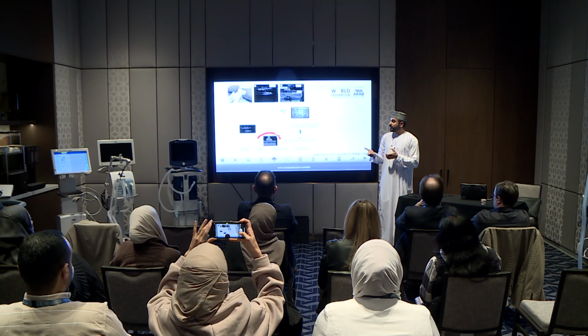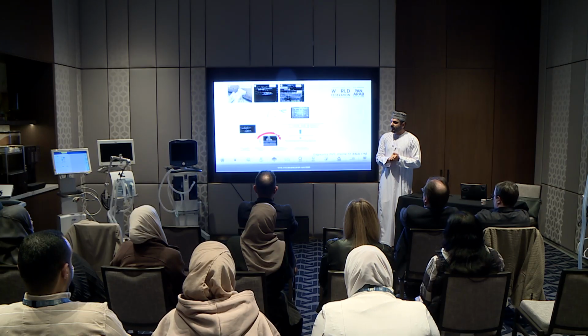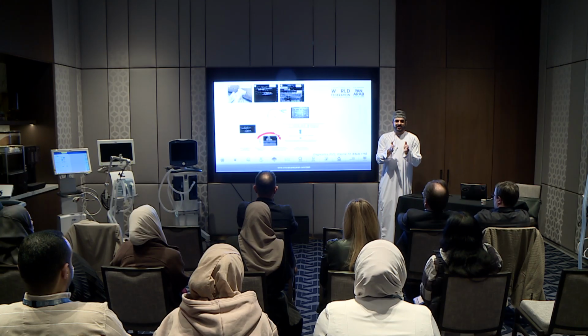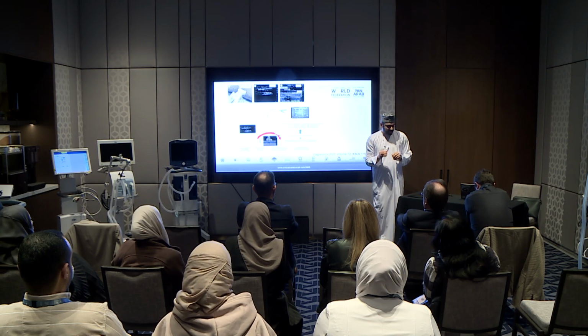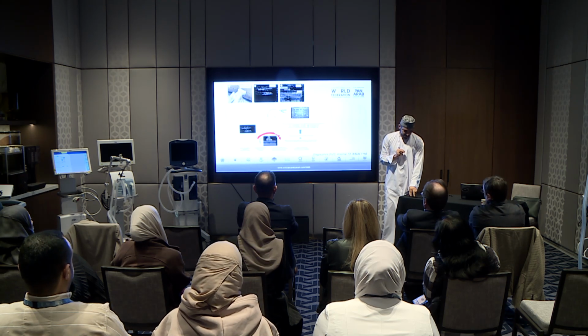So this is occlusion pressure and how it's correlated to the respiratory drive and respiratory effort. If you have now a patient with high respiratory drive and high respiratory effort, what would be the strategies that you can use to reduce it? And from the beginning, I would say it's not as simple as increasing the patient's sedation or narcotics.